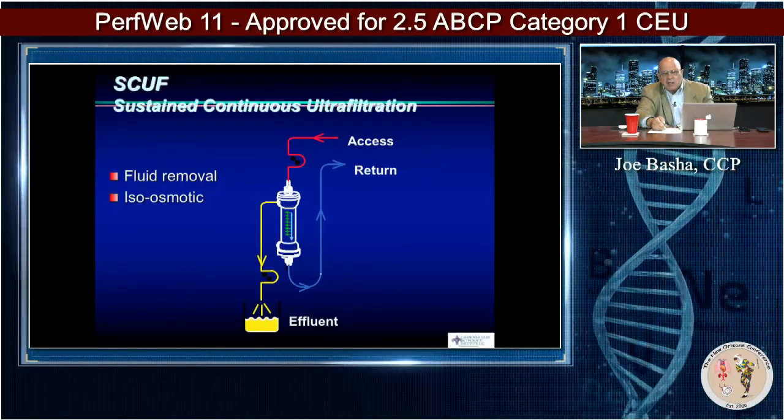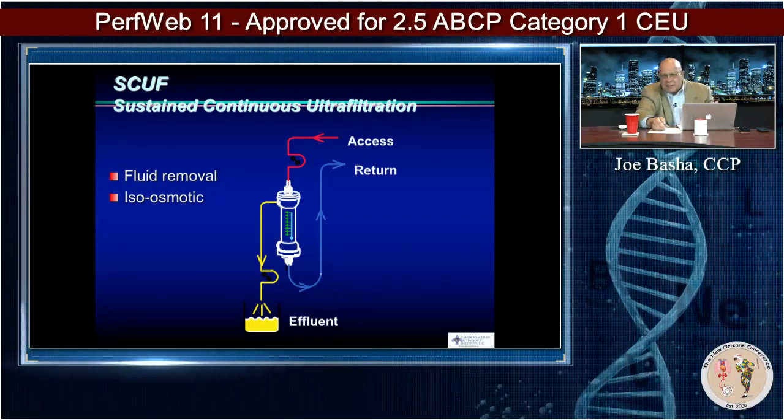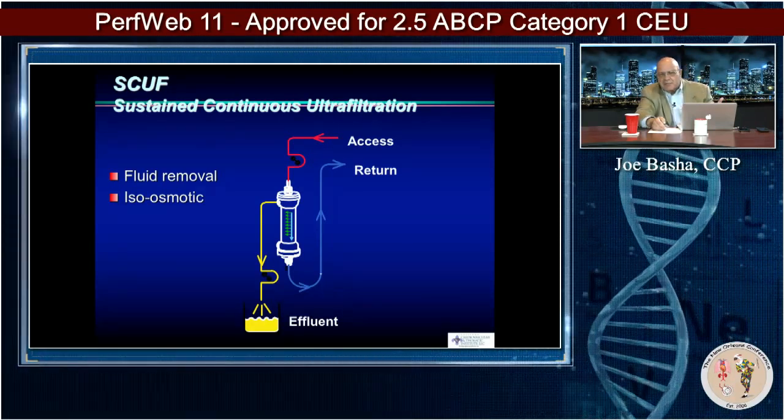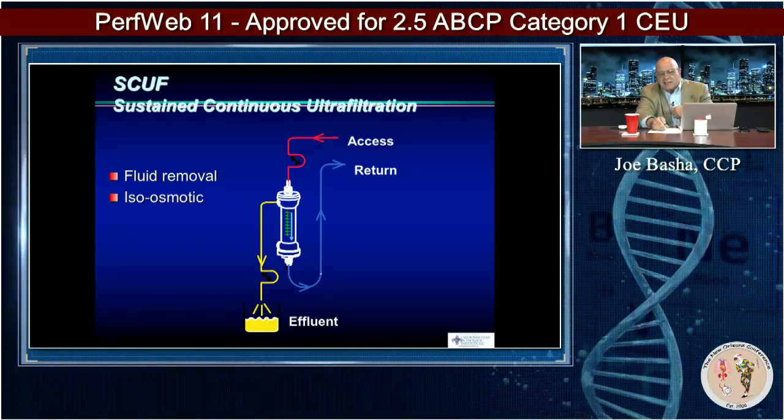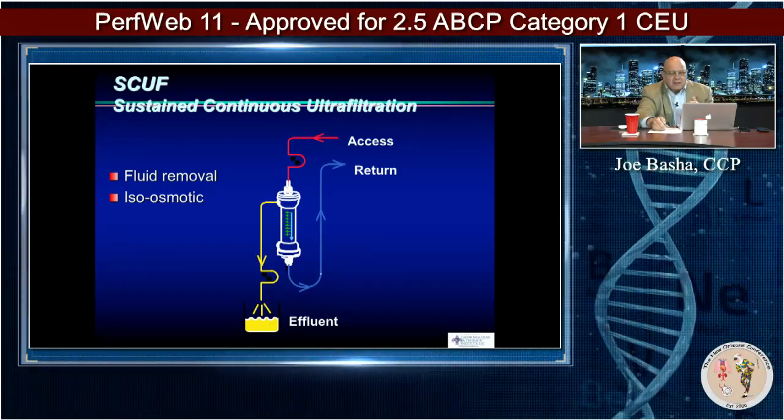So then there's SCUF, basically the same as MUF. It's essentially the same thing as us cutting a hemoconcentrator into our perfusion circuit. And it is just for fluid removal, nothing else.